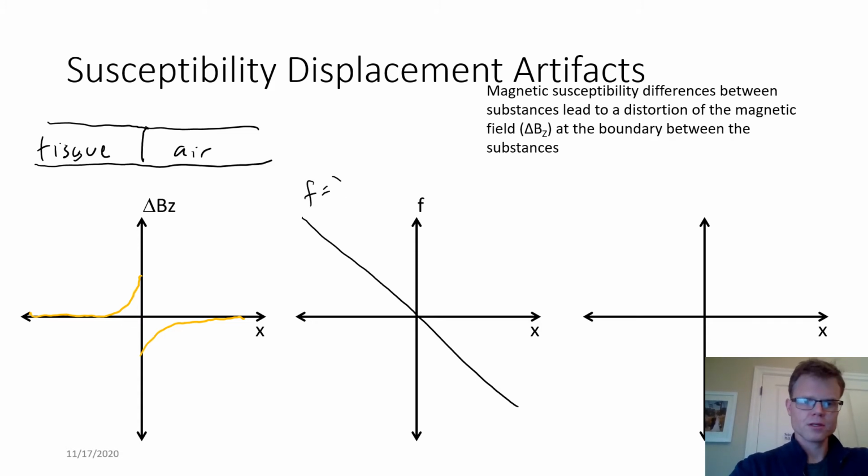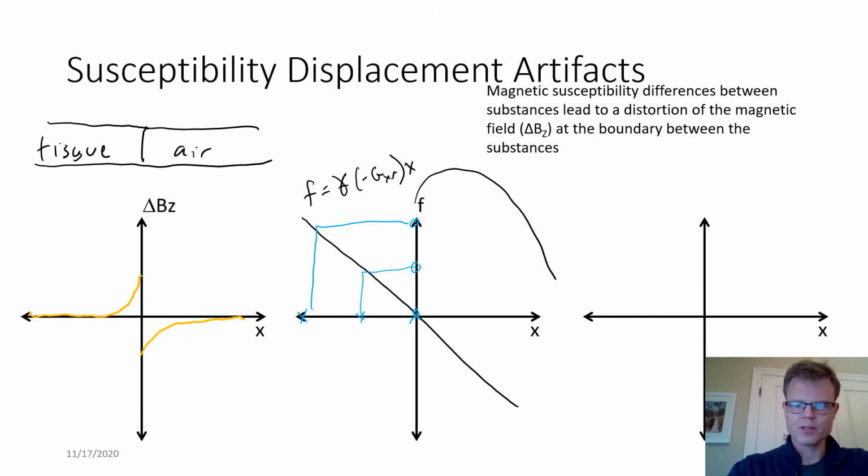So we've just done minus readout gradient here. And we'd be choosing a different value. Let's say we just flipped it around. And we can do our same nominal mapping to frequency, and I'm adding this in here just so it's clear that now we're going to map the frequency in the opposite direction.